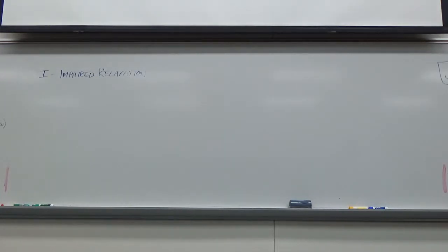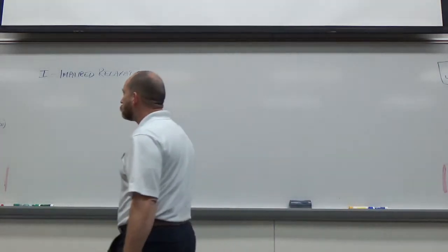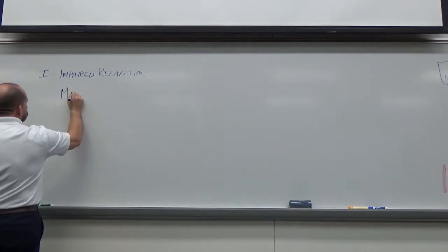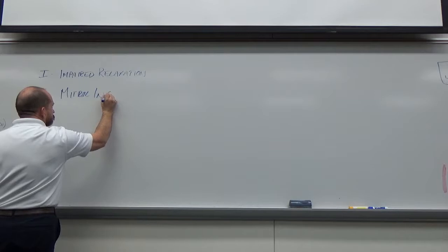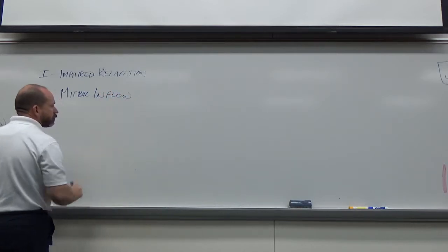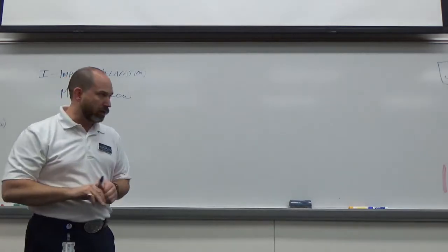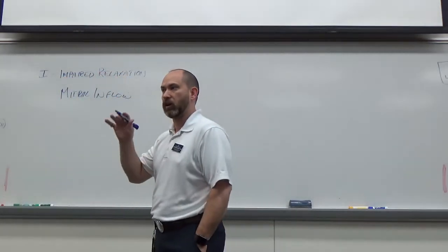All right. So impaired relaxation. What's the first thing we look at then? Mitral inflow. So what are our first signs on mitral inflow? Increased A-level. So we could take that 50-50 view, 50 feet away at 50 miles an hour. Just look at what your waveform looks like without having to calculate the numbers.